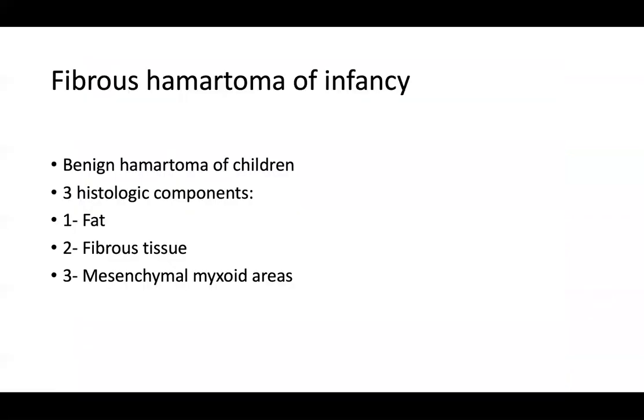Moving on to an entity called fibrous hamartoma of infancy. So this can show up definitely on your exams and your recertification questions in both dermatology and dermatopathology. I like to think of a fibrous hamartoma of infancy as being a benign hamartoma, often in children or in infants, obviously, but it's composed of three histologic compartments or components. So you often have fat, you've got some fibrous tissue, and you have mesenchymal myxoid areas.